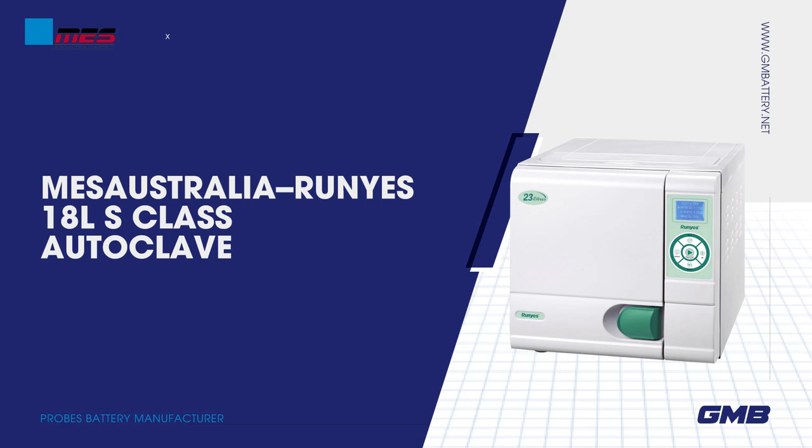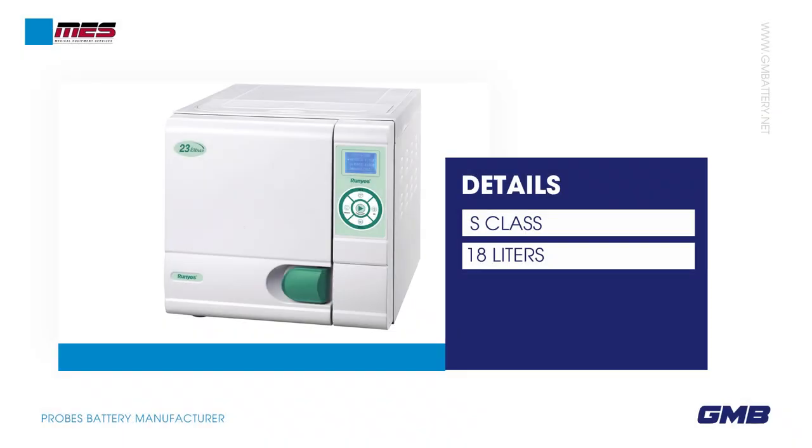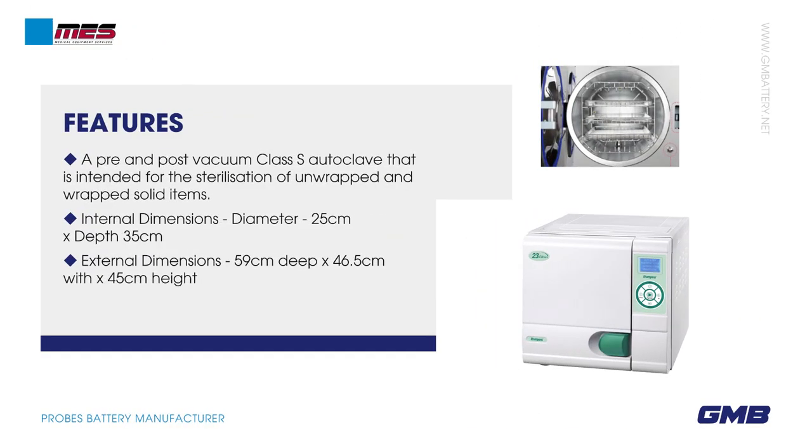MES Australia Runny's 18L S-Class Autoclave. Features a pre- and post-vacuum Class S Autoclave that is intended for the sterilization of unwrapped and wrapped solid items.